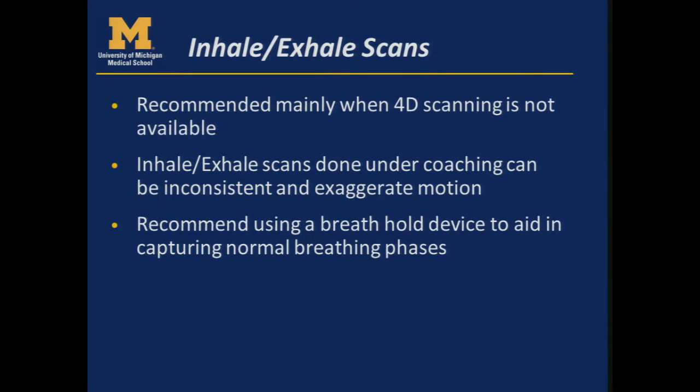Inhale-exhale scans, as I mentioned, if you don't have a 4D CT, you could employ this approach for motion management. Otherwise, I think 4D CT is really the gold standard for measuring motion for a free-breathing patient. Keep in mind that inhale-exhale scans done under coaching can be somewhat inconsistent. If you just try yourself to hold at a normal inhale or a normal exhale without exaggerating the breath hold, you can do it very differently each time. And so if you have a breath hold device to aid in this, if you don't have 4D CT, that would be something good to look into.